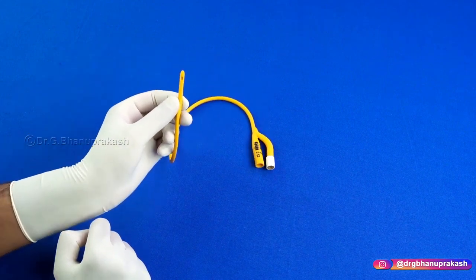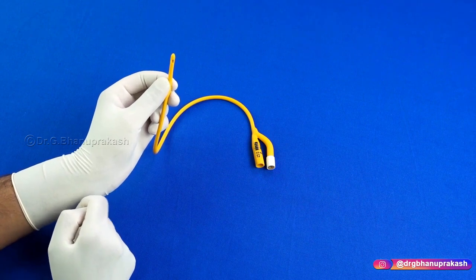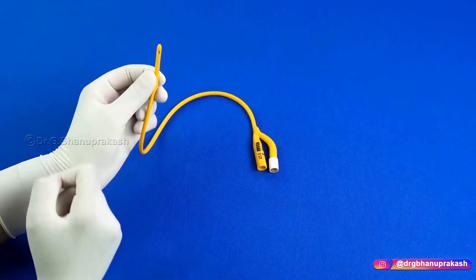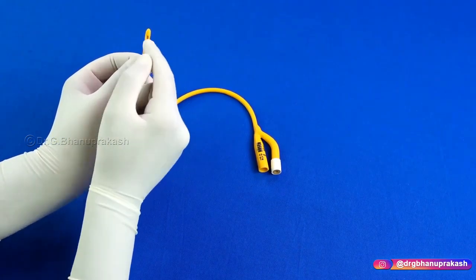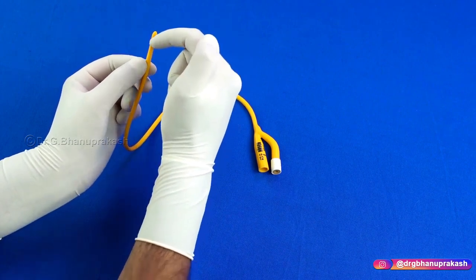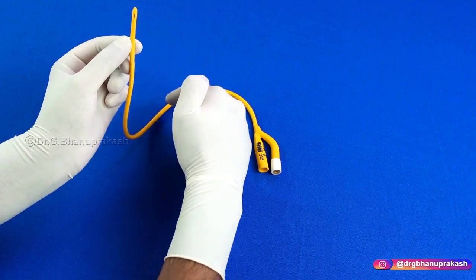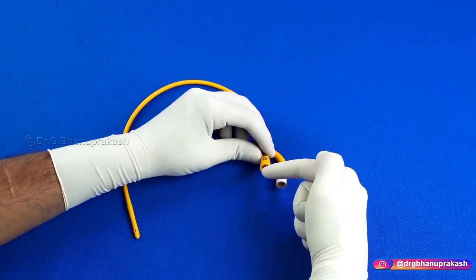Now all of you can see very well that the tip has a small aperture. This aperture will be located within the urinary bladder. It will rest in the urinary bladder and collect the urine, and the urine all the way goes down like this into the Foley's catheter and comes out of the urine drainage port.